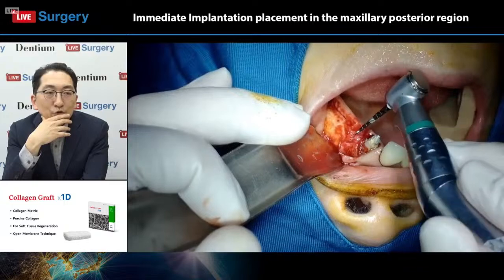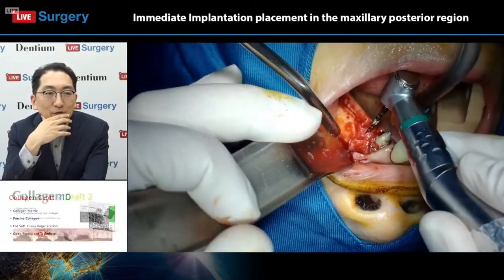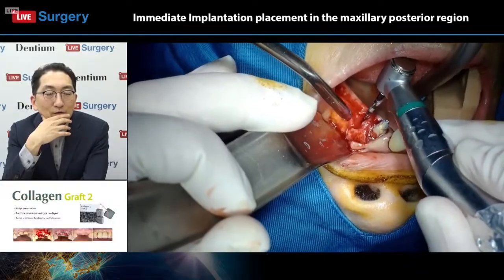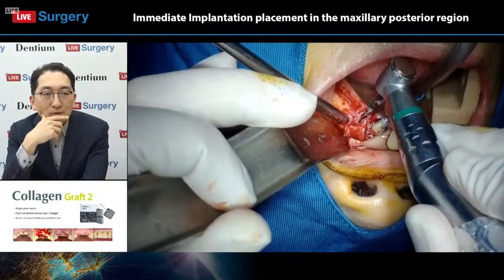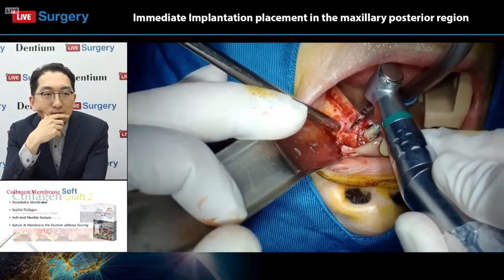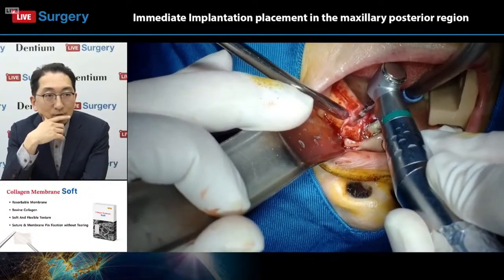Generally, the new curette I use for perio treatment, and the old curette with blunt blade is used for flap elevation like this.